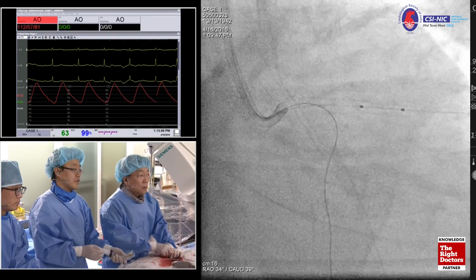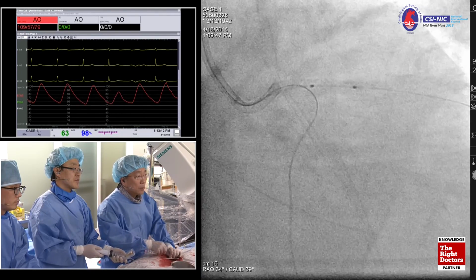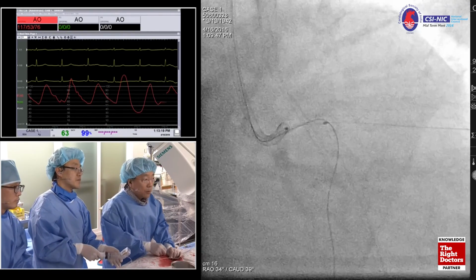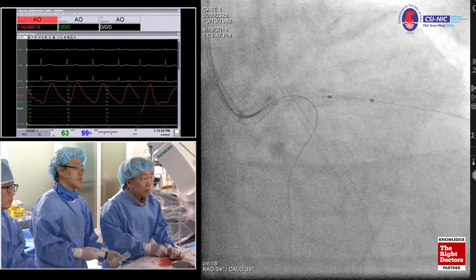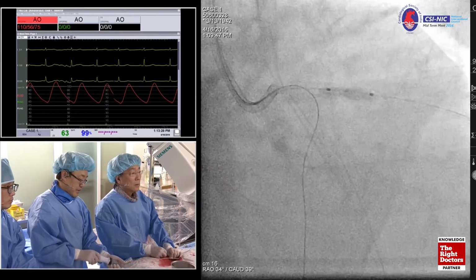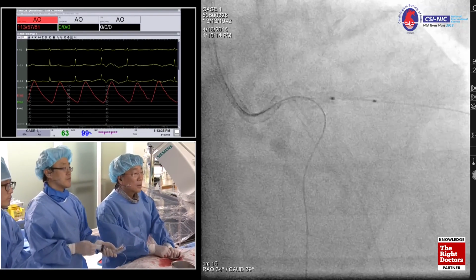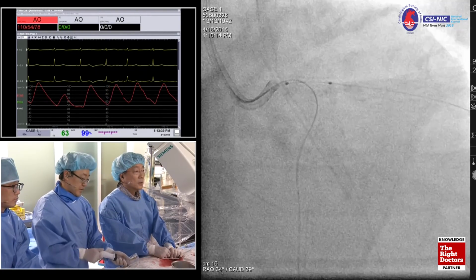Deflate, cutting one side, and I pull the device out. Actually, I rotate the device, so I want to make another aspect. Okay, here, why not 10? 10, 12. Okay, deflate. One more. Okay, why not? Inflate 6, 8, 10, 12.